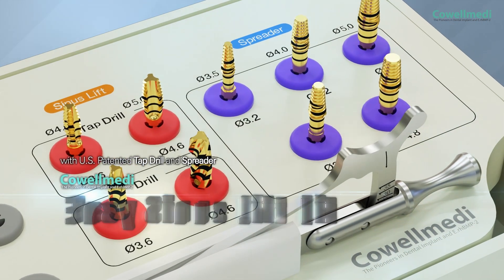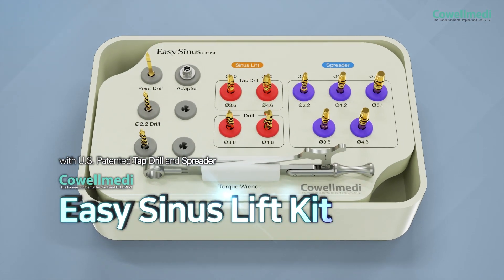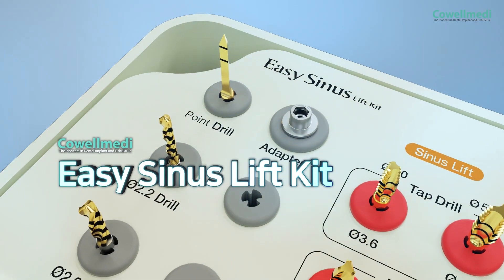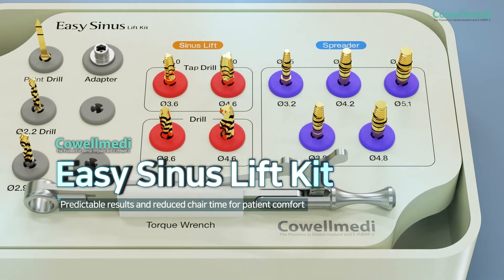Coel Medi's Easy Sinus Lift Kit provides more predictable results, shorter chair time, and a more comfortable procedure for patients.